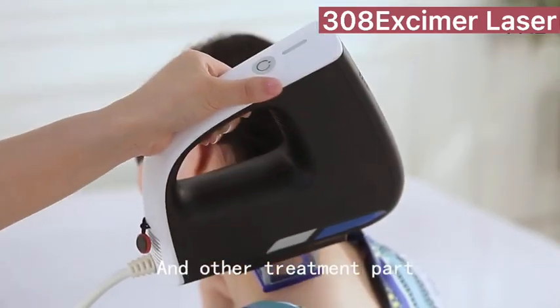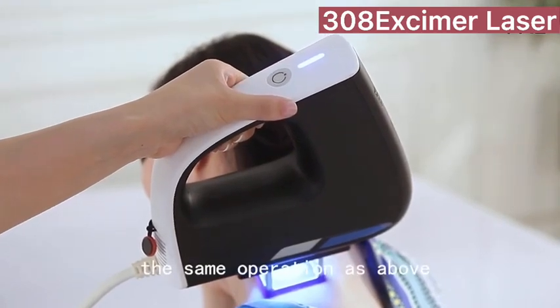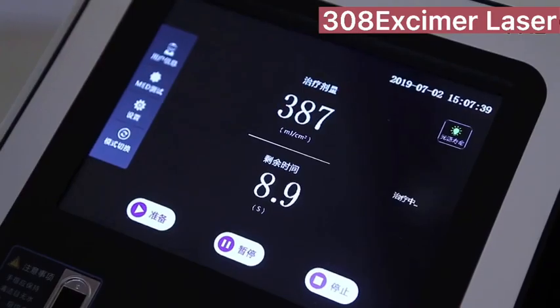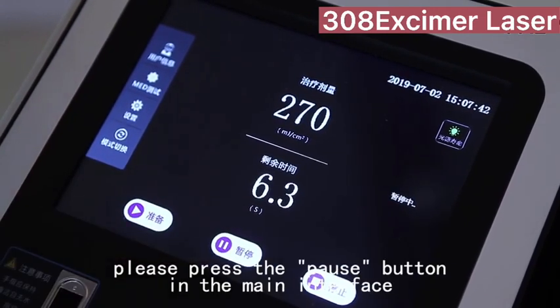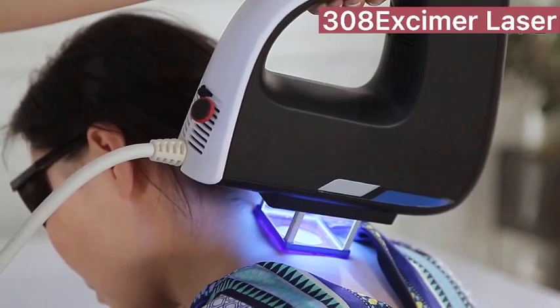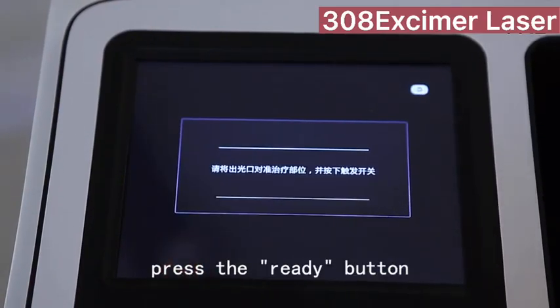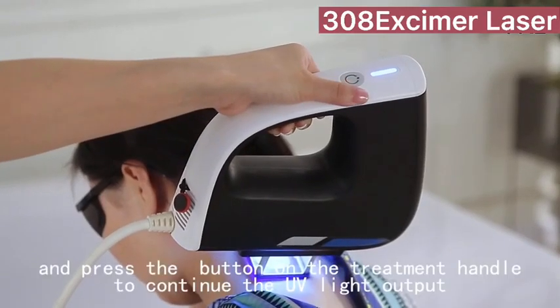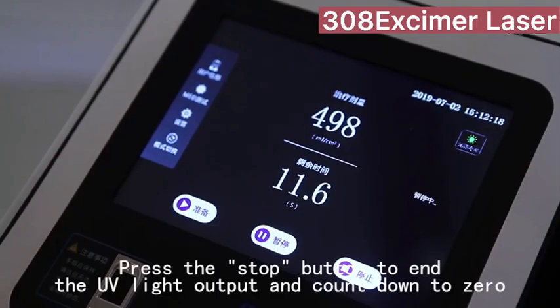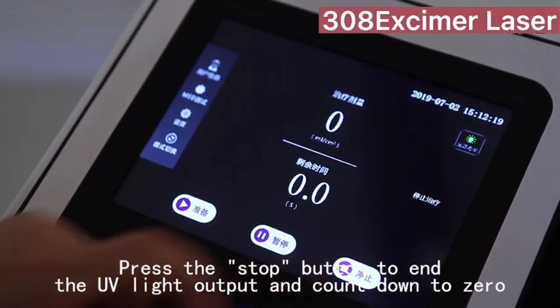For other treatment areas, the same operation as above applies. If needed, pause the treatment by pressing the pause button in the main interface to pause UV light output. If continuing the treatment, press the ready button and then press the button on the treatment handle to resume UV light output. Press the stop button to end UV light output and count down to zero.